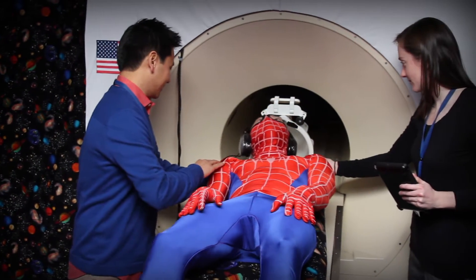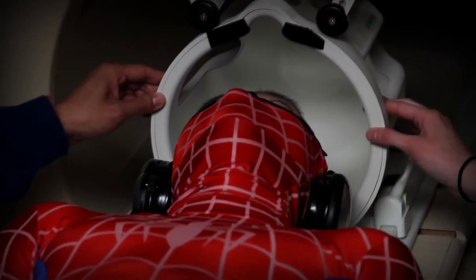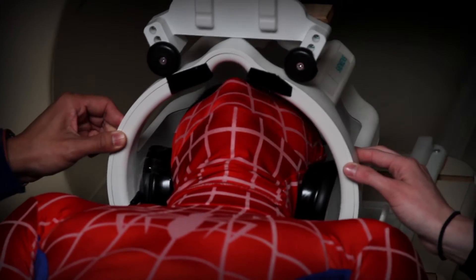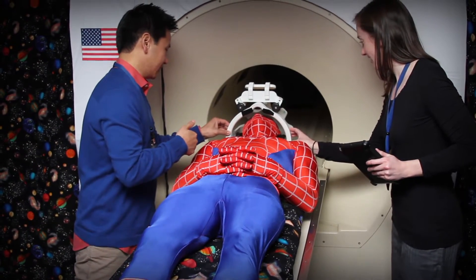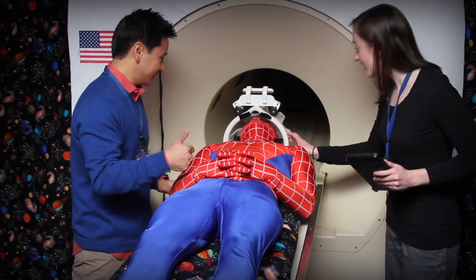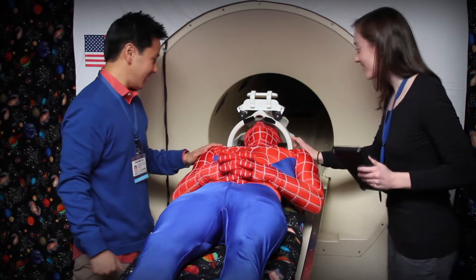You are now almost ready for takeoff, but you are missing a very important piece of your astronaut gear — your space helmet. When you are lying down with your headphones on, you will put a space helmet over your head. The helmet has a mirror so you can watch one of your favorite movies.